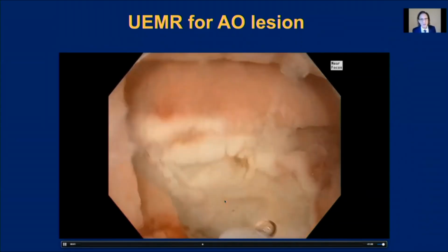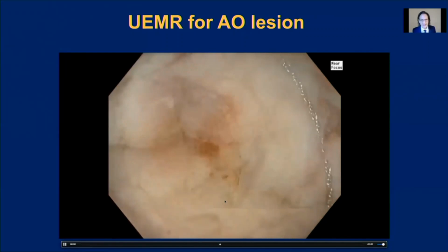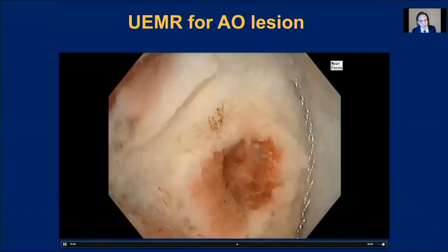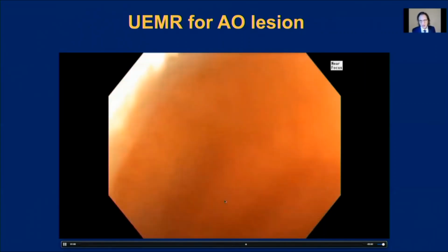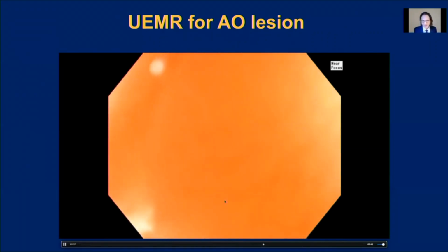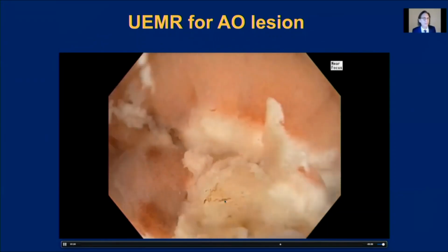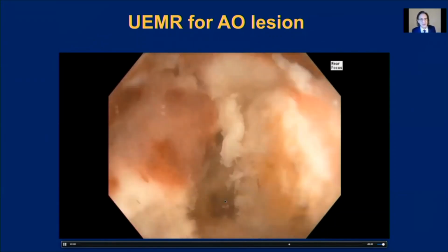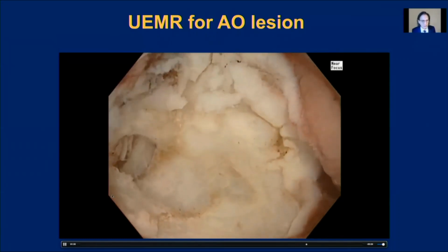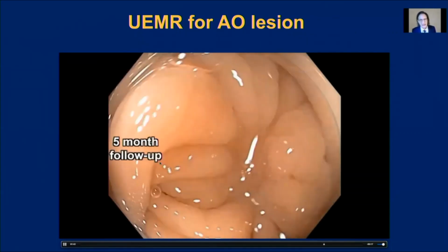And this is the specimen, but we're looking now at the base. We're going to inspect the base very carefully. And you see here at the AO itself, there is some residual. But we can also resect this residual by applying gentle suction, so this water pull effect, pulling the AO channel, which is a lumen, up into the snare and then closing the snare around that. Now, of course, we don't know how far this lesion extends into the appendix itself, and so this patient may require an appendectomy as well. But if we look now at the base, you can see it's clean, and of course we got biopsies from the base, and those were negative.